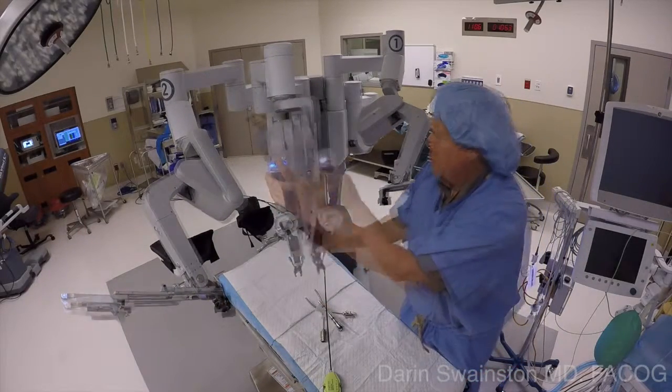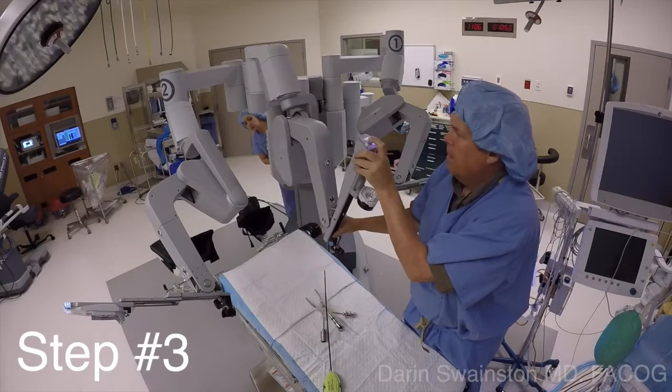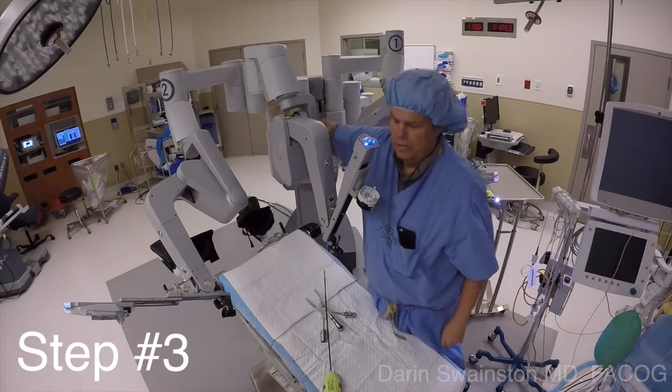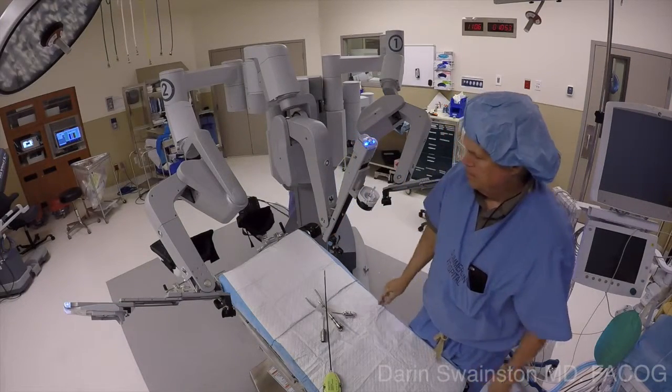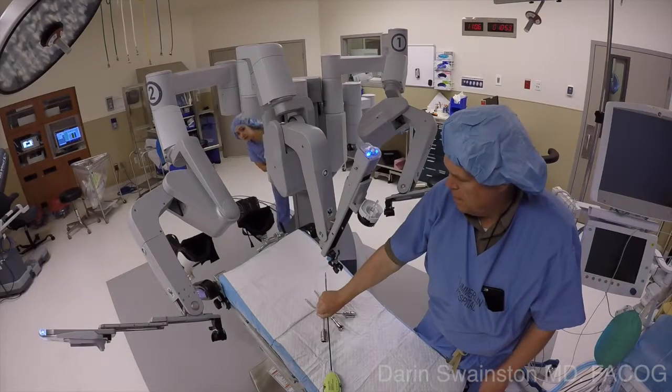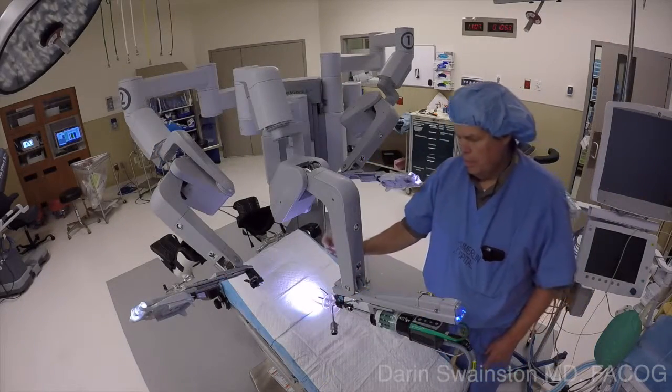Then they can stop for a moment and you can rotate. Step number three is to orient that camera port between the legs so that it's still on the outer sweet spot. Error on the side of being on the inside, not the outside of the sweet spot. Now they can finish driving the cart in — it's done.